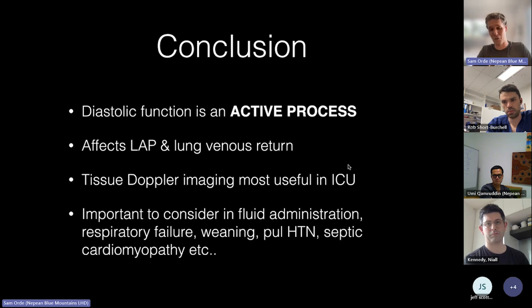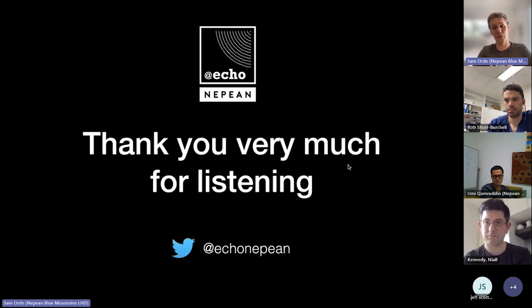And as we start to either give them fluid or take away fluid, you can reassess your left atrial pressure, potentially using things like your E to A ratio and your E to E prime, and you can look at how they change over time to give you an idea whether you are winning or not. And we'll talk more about that next week.